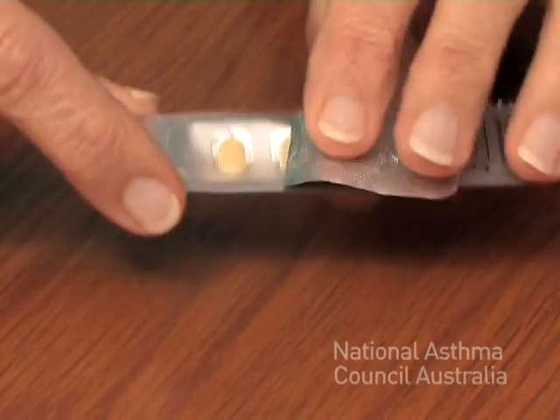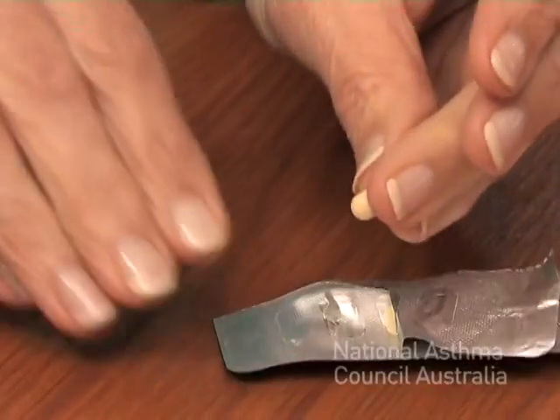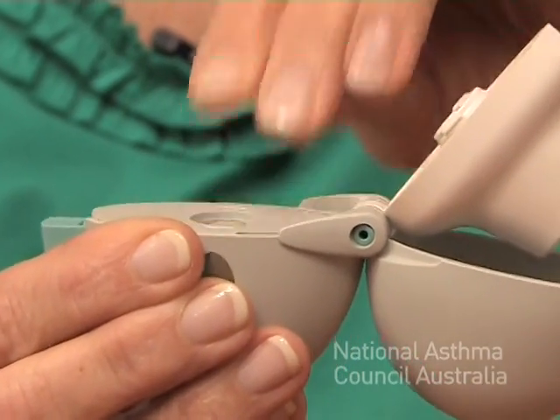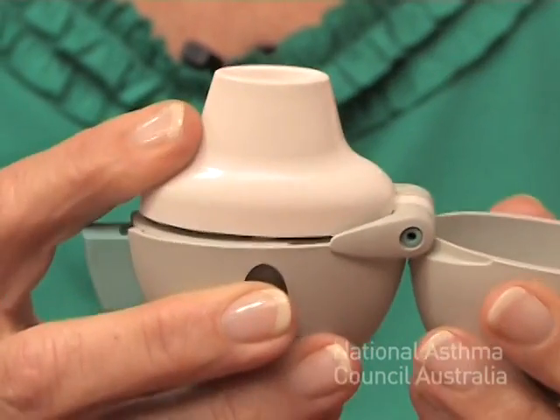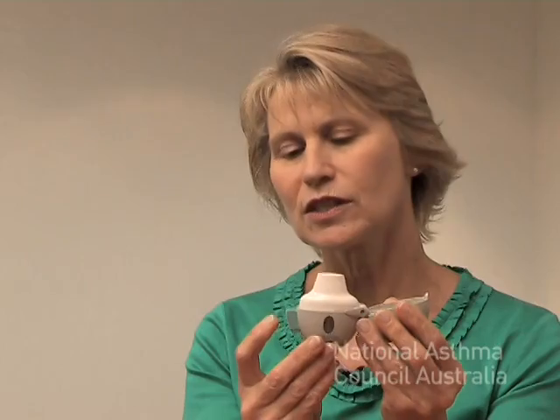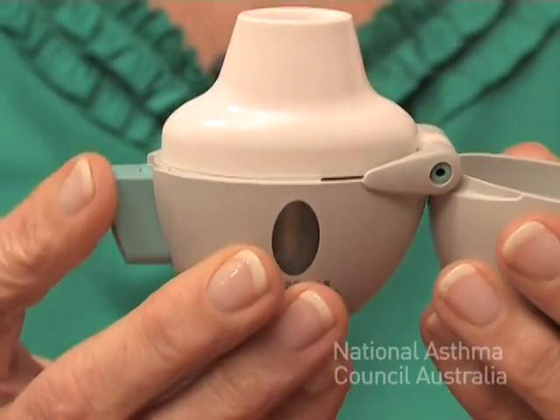So to use it, you must have the mouthpiece up. Just place the capsule in the little compartment inside, closing the mouthpiece until it clicks shut. You just need to press this lever in firmly and that will pierce the capsule. You only need to do it once.